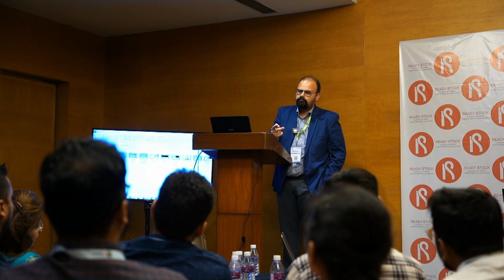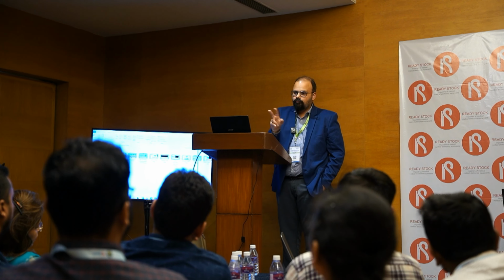I have something. There was a good study, I think, I forget the name. It came in Neurogastroenterology or something. They compared OPD based balloon expulsion test in an OPD with a normal, easily made equipment versus a manometry. So, just to diagnose dyssynergia, both are equally good. In fact, what I am telling you is even doing a PR is good enough in my OPD to tell that this patient has dyssynergia. What it does not tell you is what to work on. If you have to work out of two components, which is the weaker one? So, if patient is able to pass a balloon expulsion in the OPD or do a good PR, which is like pushing my finger out, is fine.